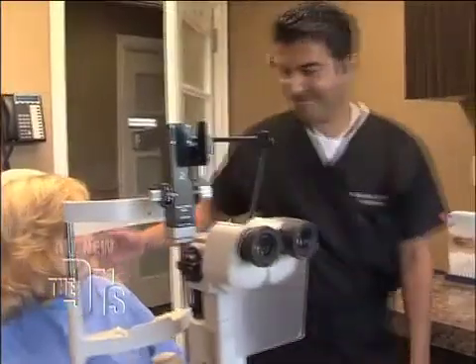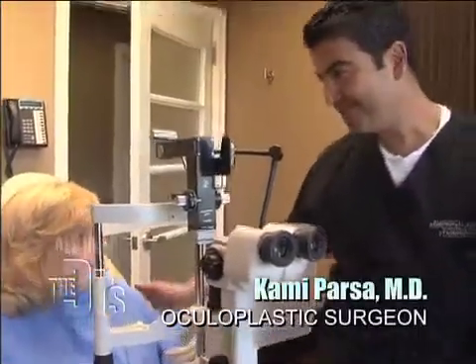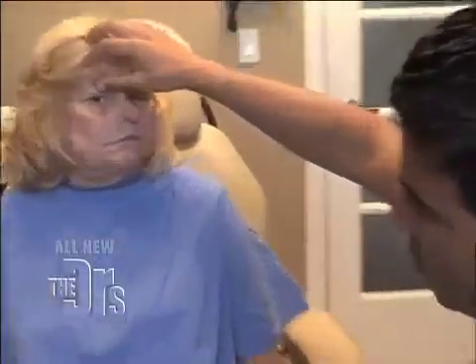Hi Laura, how are you? I'm fine. How are you doing? Great. You ready for the big day? You bet. Close your eyes and open. We're placing a gold weight in your upper eyelid and that will help close it, and also I'm going to raise your lower eyelid up so it gets tighter. Great, finally.